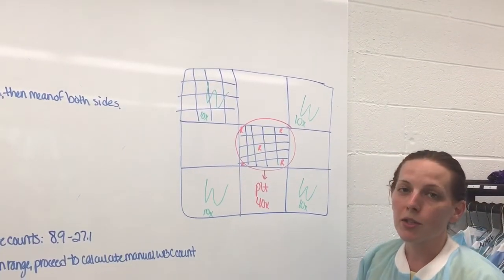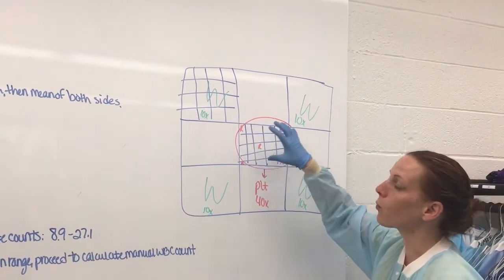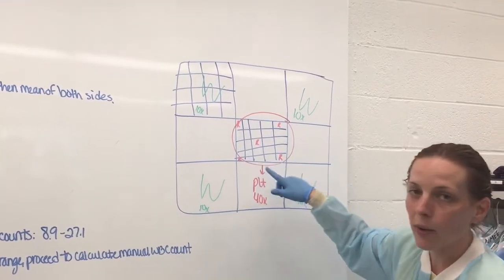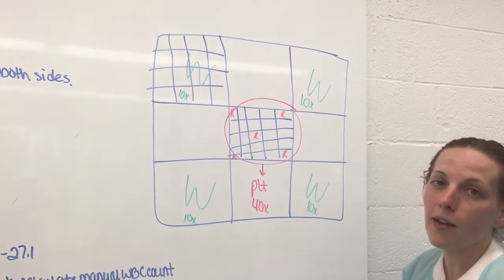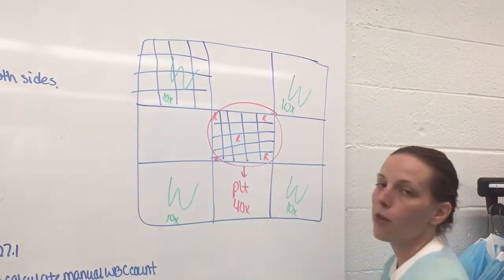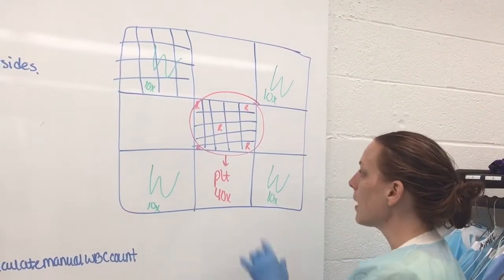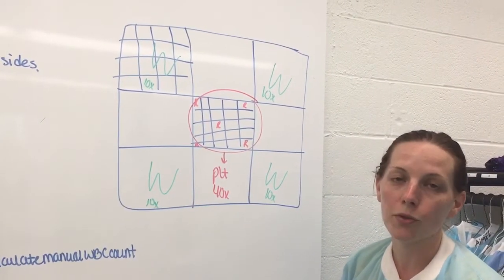However, you can also use hemocytometers to do manual red blood cell counts and also to do manual platelet counts. If you were to do a manual red blood cell count or a platelet count, you would do both of those on 40x. When you do a red blood cell count, you use the middle square out of all of the 9. And the middle square itself is divided up into a grid of 25 smaller squares. And within those 25 smaller squares, you count the 4 corners and the 1 in the very middle. So you count 5 out of those 25 smaller squares within the central square millimeter. If you do a platelet count, you actually count the entire 25 squares of that central square millimeter.